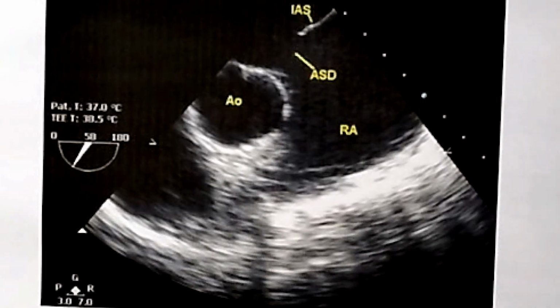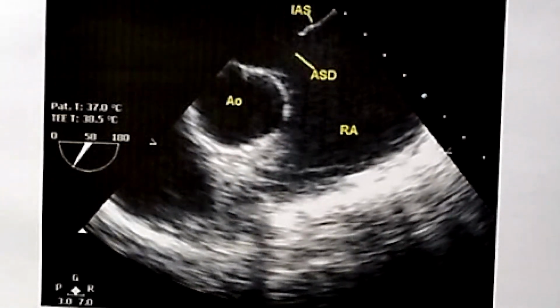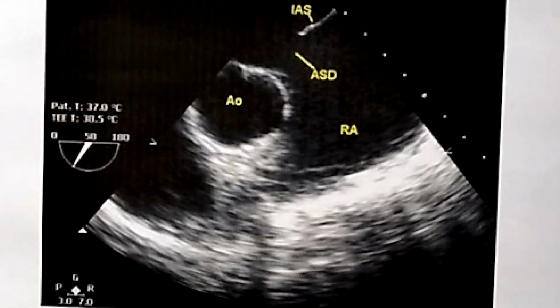Before proceeding with the device closure, an excellent image of the atrial septal defect has to be obtained using transesophageal echocardiography. In transesophageal echocardiography, as the transducer is very close to the left atrium in the esophagus, higher frequency imaging with better resolution can be used.